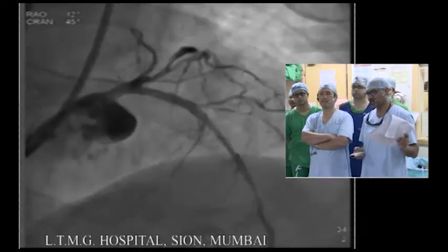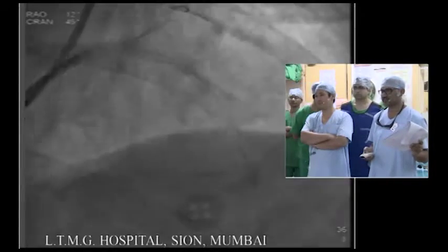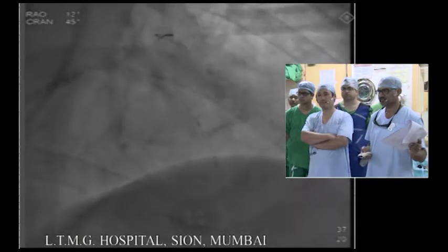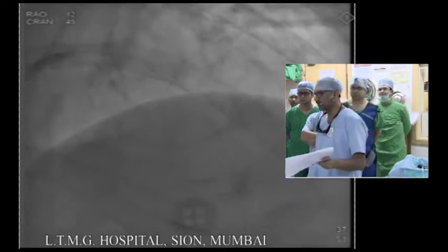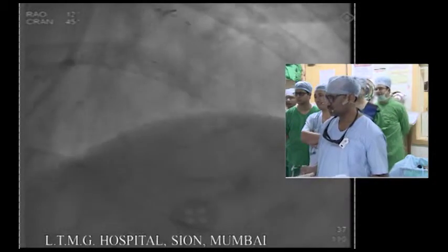And then we did the OCT. So now I will show you the first OCT run. First OCT run.